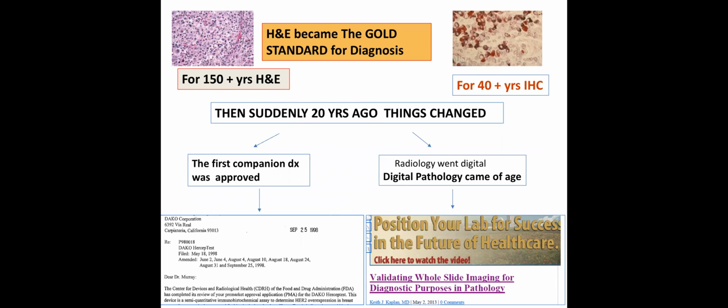About the same time, radiology went digital. And this was, again, technology-driven as the cameras used went to digital mode. And at that time, it became clear that digital pathology was going to develop, and studies began to appear over the next couple of decades, validating whole slide images for diagnostic purposes. And in fact, there is now an approved whole slide image system from Philips for that purpose.